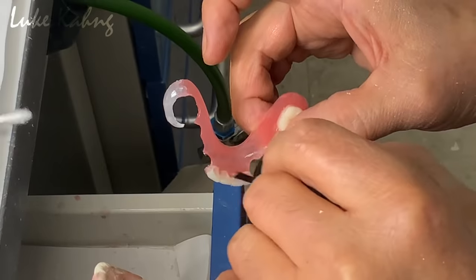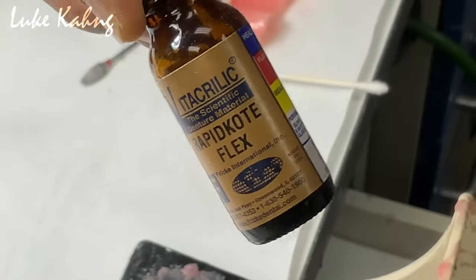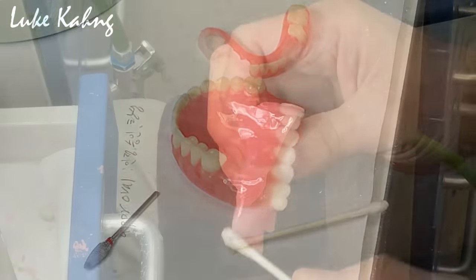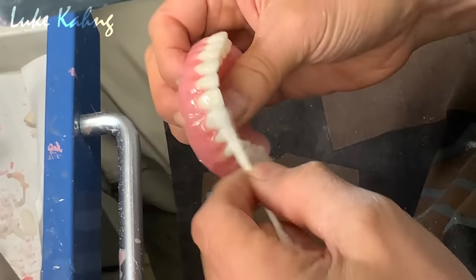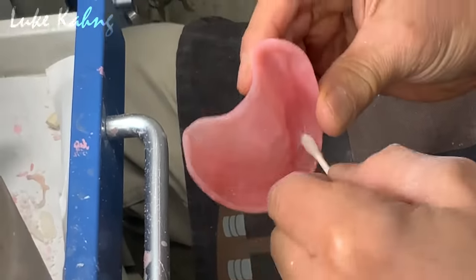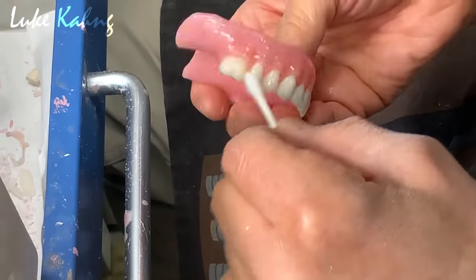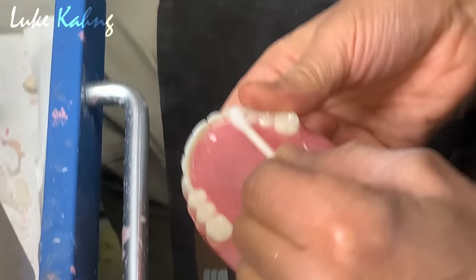The varnish with the company is the local one from Illinois. Can you see? Yeah. Oh, yeah. So this one is a mineral oil. After polishing, we put the final mineral oil to make the shine on the dentures. So we can finish both top and bottom. Now it's ready to go.